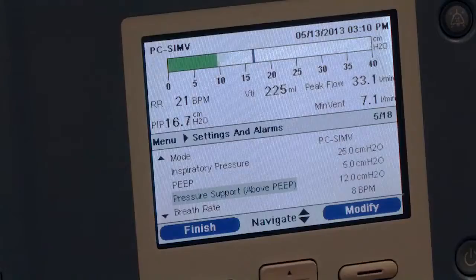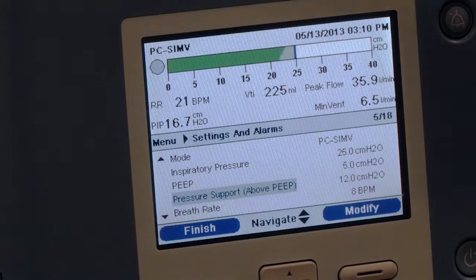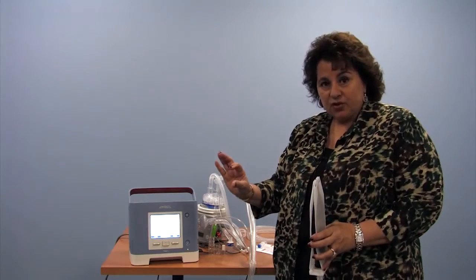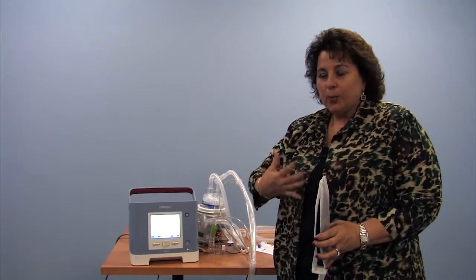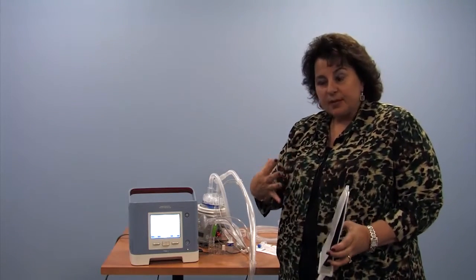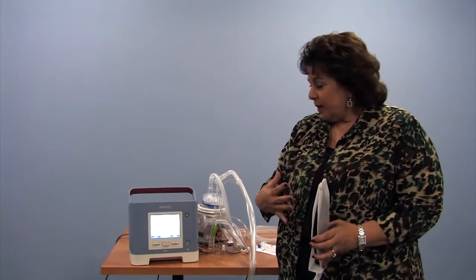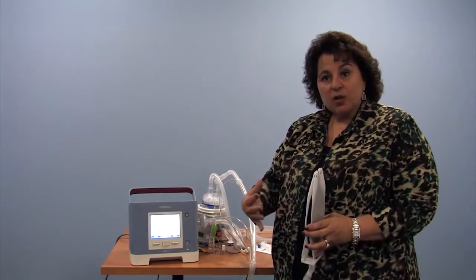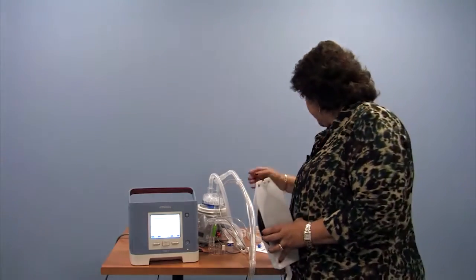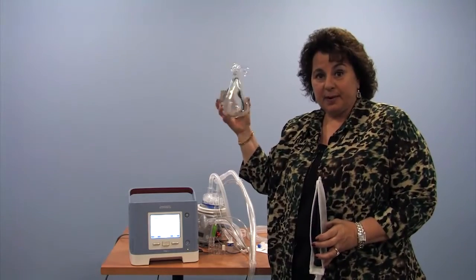So our patient now, who has 8 mandatory breaths that go up to 25 and down to 5, doctor prescribed, and in between those 8 breaths, our patient can use pressure support, which helps them overcome resistance of breathing through a tube, for example, and perhaps they have some issues with their lungs, which is possibly why they're on the ventilator. They need a little help with breathing. We give them what we call pressure support, otherwise known as BiPAP. BiPAP is a term we use when we see a mask on a face, like this. A mask on a face typically means BiPAP.